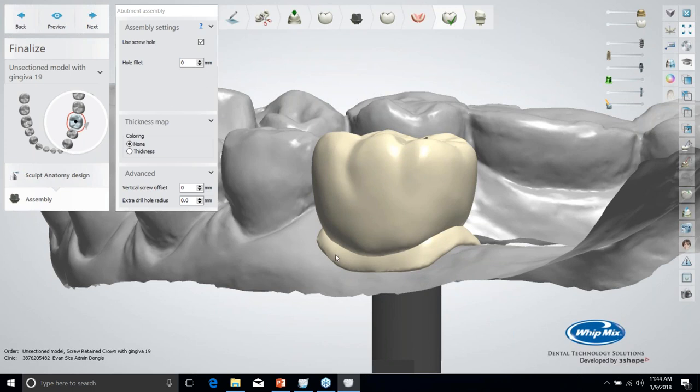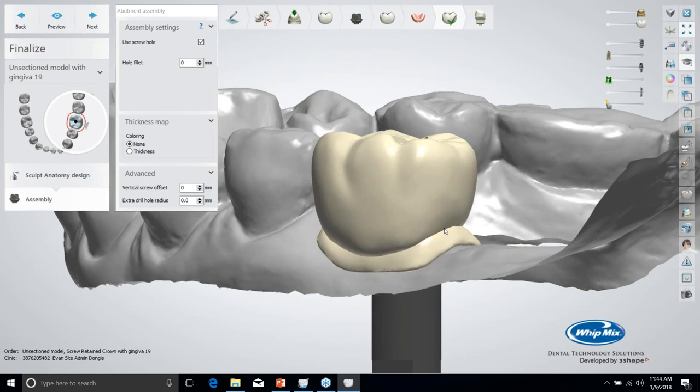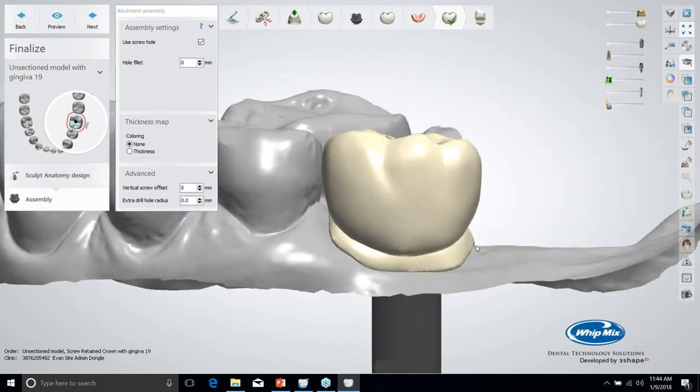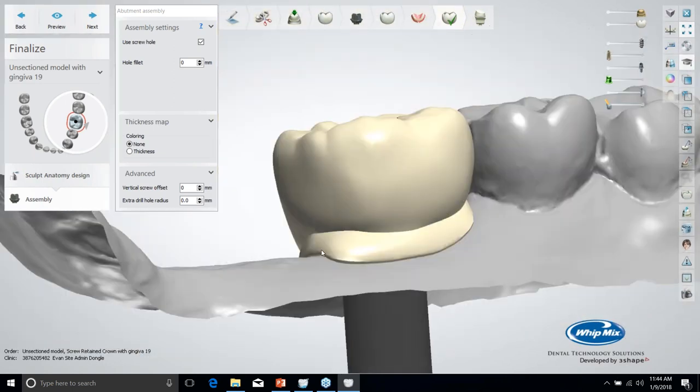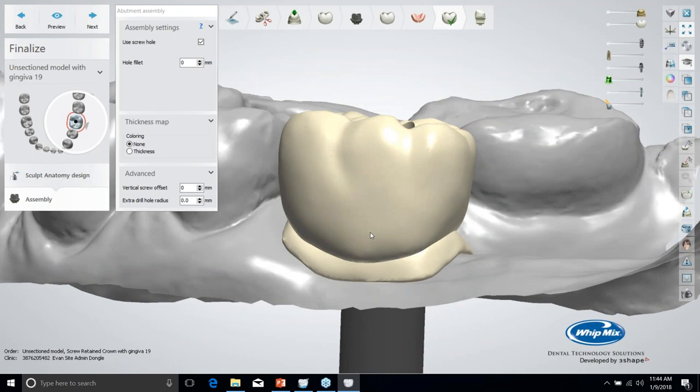But when you add this tissue to it and a screw hole, the mill has to be able to analyze essentially the insertion direction from both sides and find this undercut and remove this material. Otherwise, like on a four-axis mill, this whole undercut here is going to be filled with zirconia, and you'd be hand-carving it. So essentially the whole cervical third of this restoration.